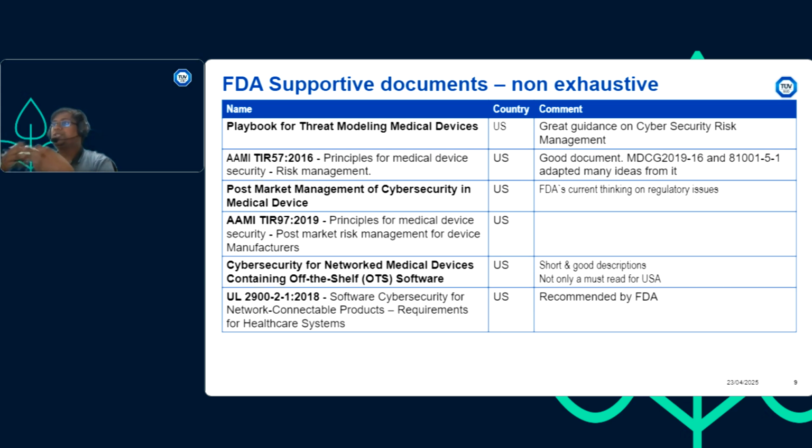But for those who want to go into detail and understand these techniques and the way of doing them, FDA has a very good supporting document, which is the playbook for threat modeling of medical devices. It's very good guidance on how you should do the threat modeling part.